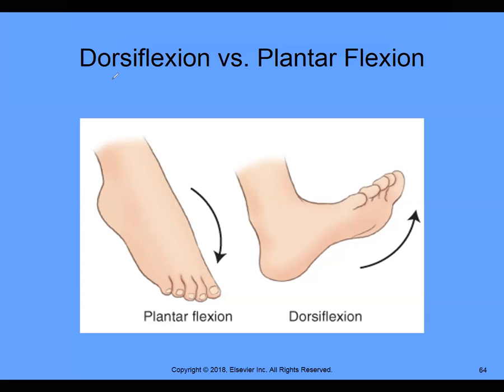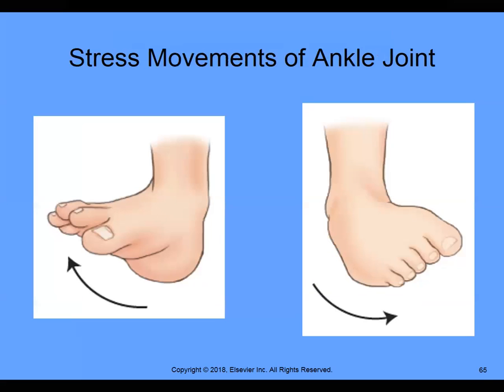On the foot, if you point your toes down, that's plantar flexion. If you point your toes up, we call that dorsiflexion. And sometimes on certain x-rays, it'll say dorsiflex the foot or do a plantar flexion on the foot. These are called stress movements of the ankle joint.